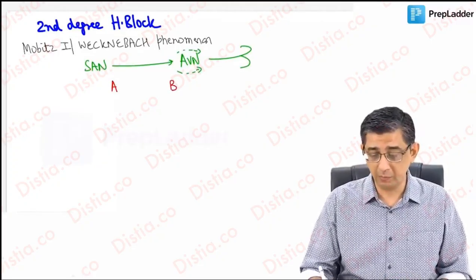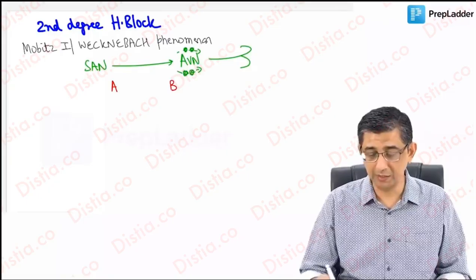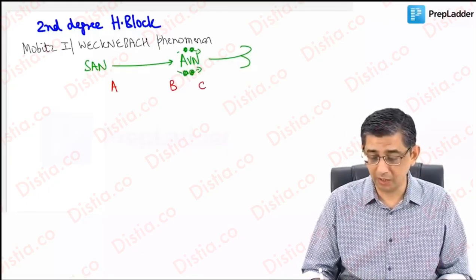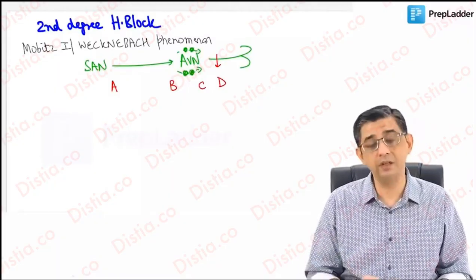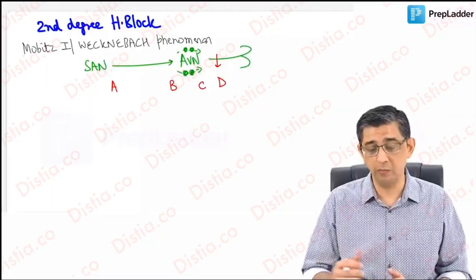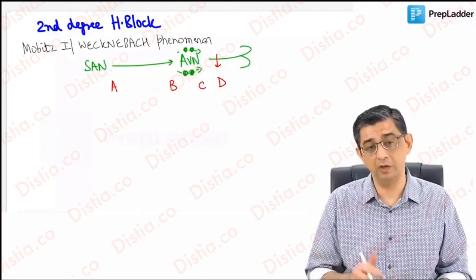Yes, there is definitely a problem because the AV node is conducting even slower than what it normally does. But at the same time, the way I've drawn the diagram before you, I wanted to highlight that the exact site of lesion in these patients is between point B to C, and that is inside the AV node. So a lot of times they might use the word intranodal to describe Mobitz 1 heart block. Now let us understand how the ECG of this person will evolve.